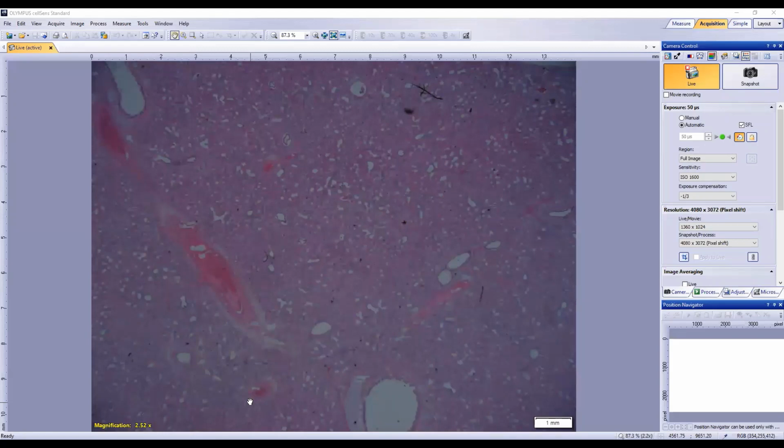So what is it, Haley or Madison? Unmute and talk us through what an embolic pattern is going to look like. So Rhodococcus doesn't tend to have that diffuse appearance with the lung equally affected, from what I remember. Exactly, abscesses forming because it's coming hematogenously to the lungs rather than an inhaled thing. So you get the big areas that are affected with more normal lung in between. Yep, exactly. So we're going to have patches of normal, kind of chicken wire lung.